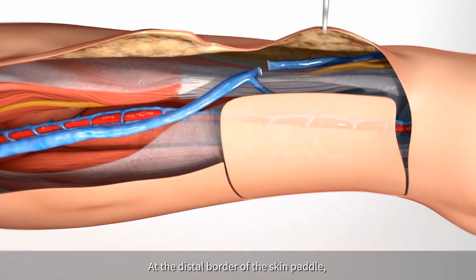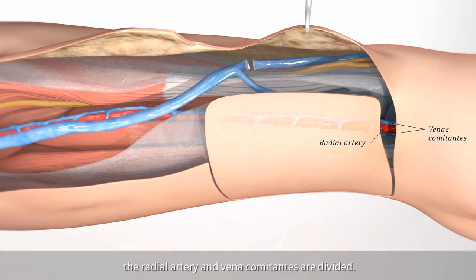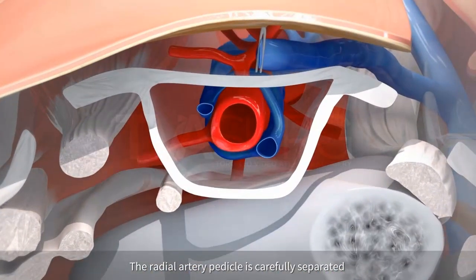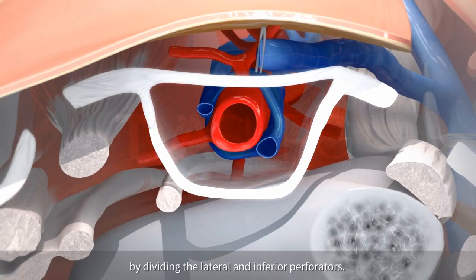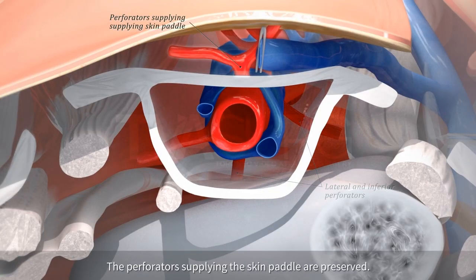At the distal border of the skin paddle, the radial artery and venae comitantes are divided. The radial artery pedicle is carefully separated from the deep fascia by dividing the lateral and inferior perforators. The perforators supplying the skin paddle are preserved.